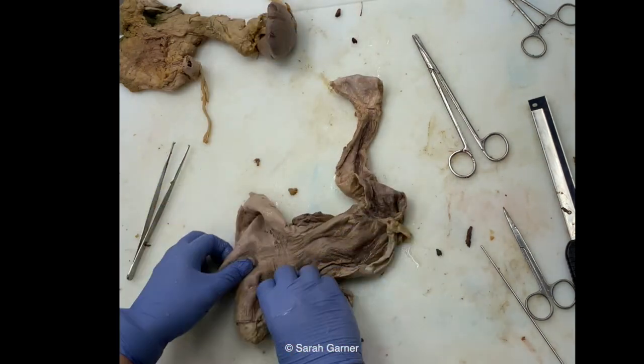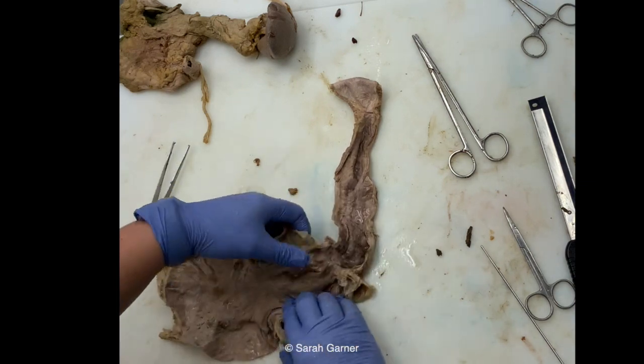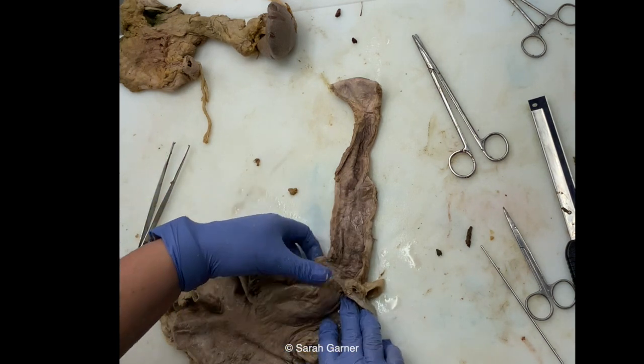So I've just rinsed it out, and when you're rinsing it out, I'll warn you to be gentle with the water, because if you put the pressure too high, it can disrupt the mucosa a little bit, so you want to be careful with that. But really this looks pretty normal. I don't see anything abnormal.